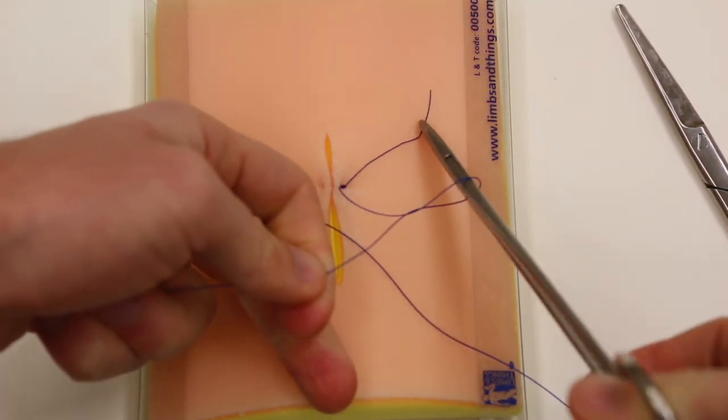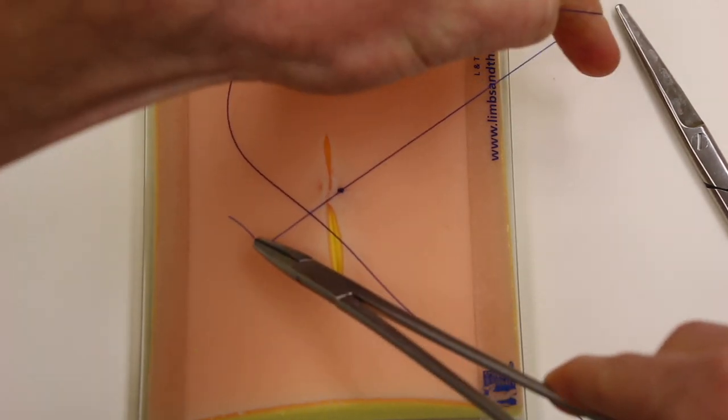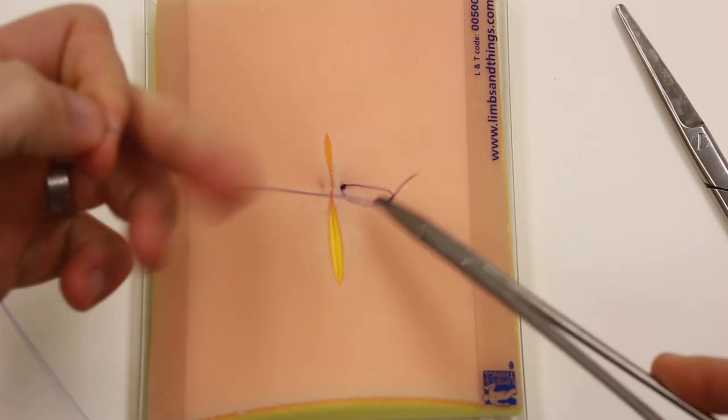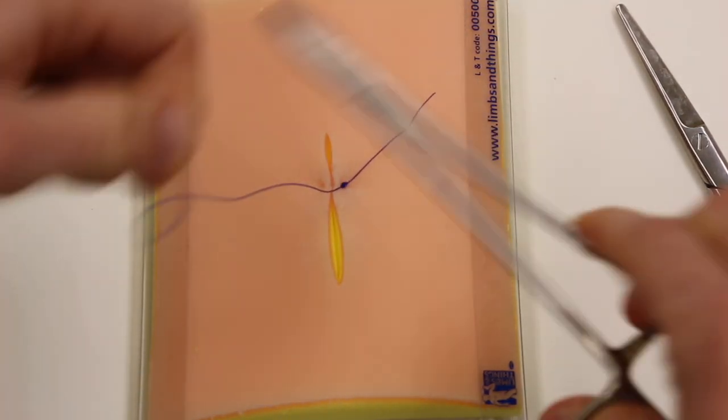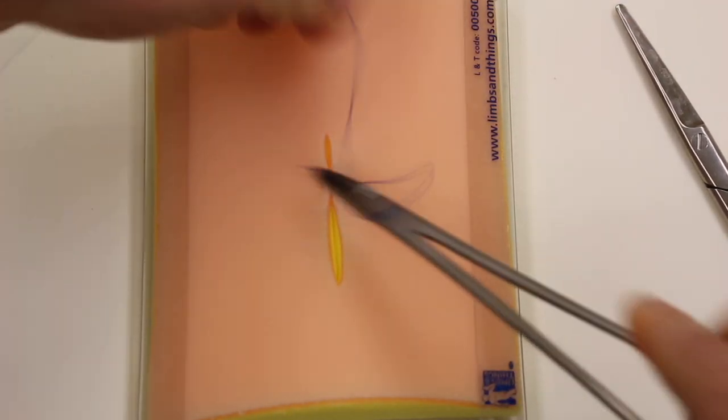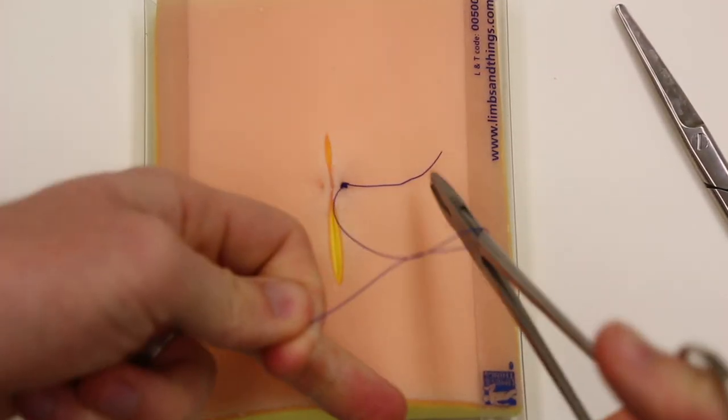And then you're going to want about six knots with these synthetic monofilaments. They tend to walk out the knots too. So it's three, four, five, and six.